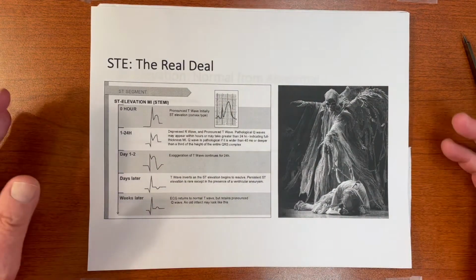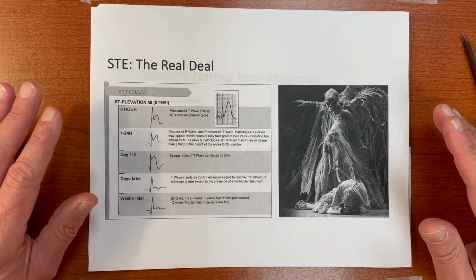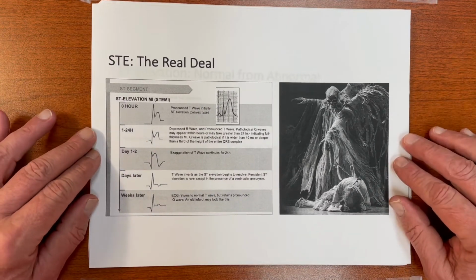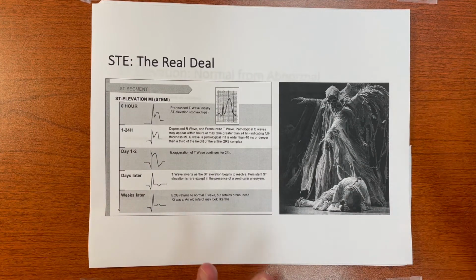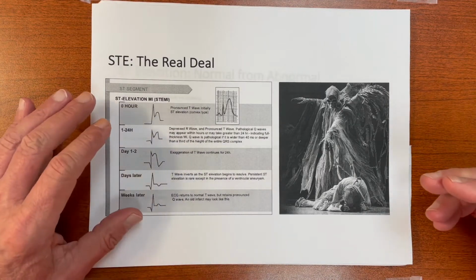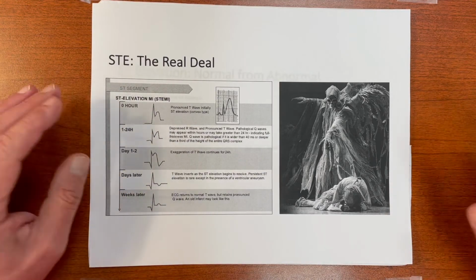And so I want to remind everybody too, as we move on here, that with everything that we're mentioning in this initial presentation, we're going to have a blowout detailed presentation on it in the differential, so we'll be able to, it's like peeling an onion. We'll be able to look at it in more detail and understand it better. This is just an overview, okay?